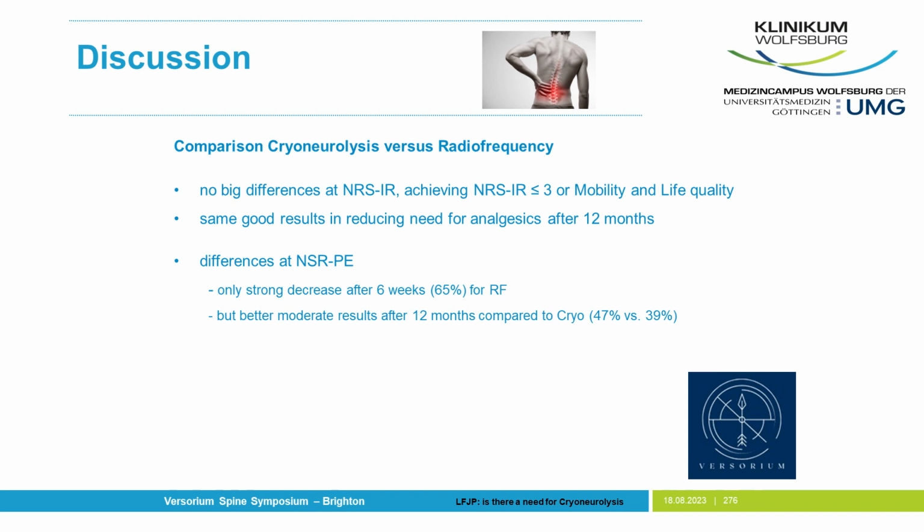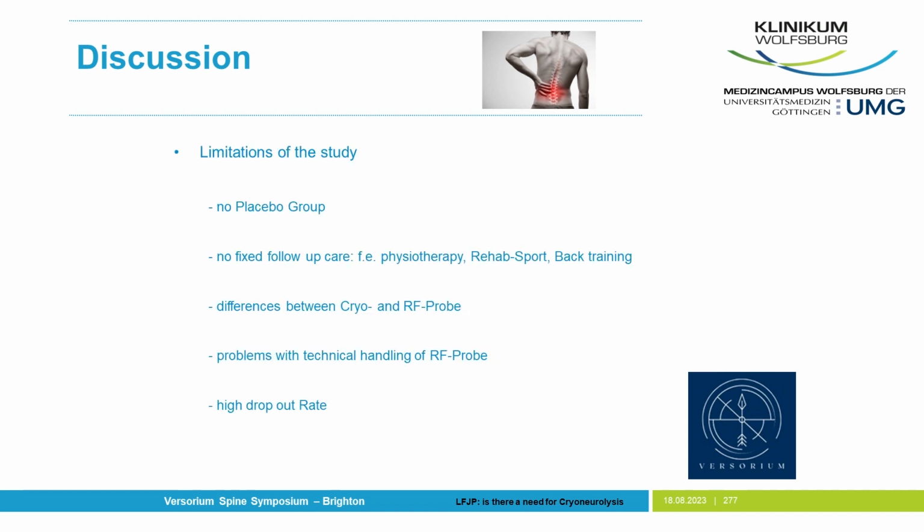These are the limits of our study. We had no placebo group. We had no fixed follow-up. Our patients get an instruction letter after the dismissal. We have a difference between the size of the probes. Probably there are some problems with the technical handling of the ERF probe, and we had a high dropout rate.